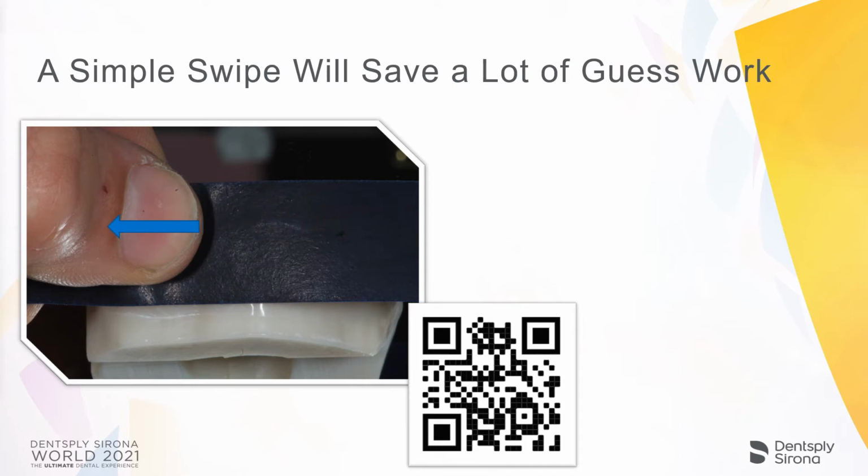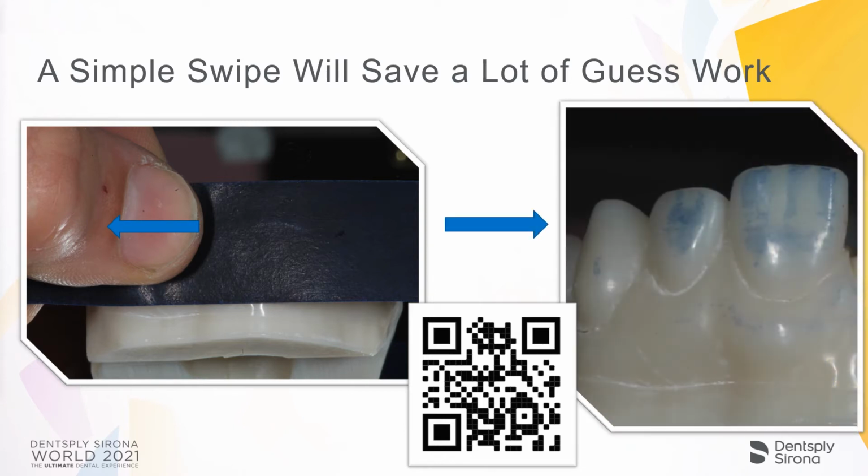So if you don't want to go to that link, you can just imagine I'm going to take that articulating paper across my model, and we're going to mark the heights of contours of our teeth. So overall, we're starting to develop our topographical map.